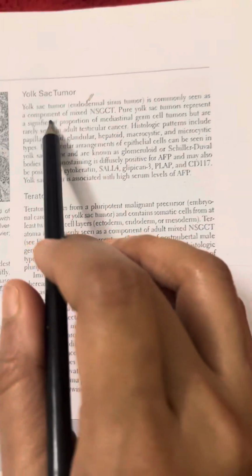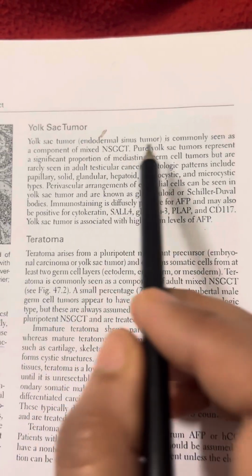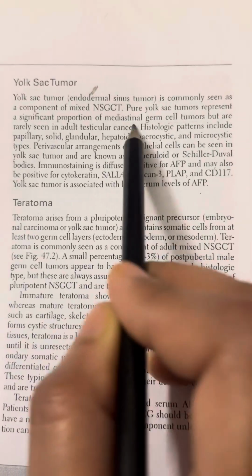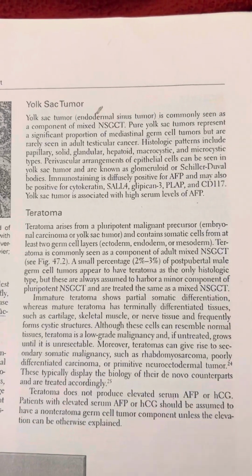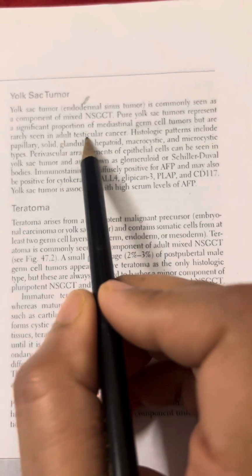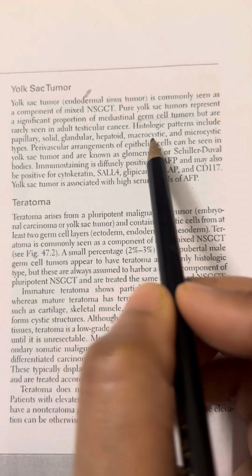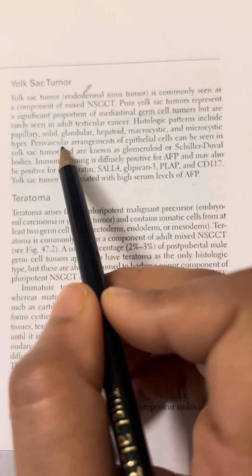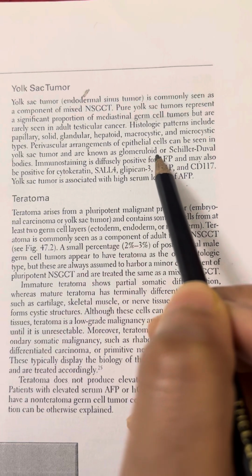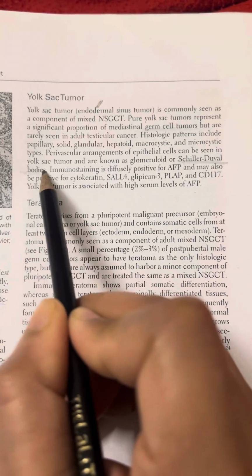So yolk-sac tumor. Yolk-sac tumor, or endodermal sinus tumor, is commonly seen as a component of a mixed NSGCT, and pure yolk-sac tumor represents a significant proportion of mediastinal GCT, but is rarely seen in adult testicular cancer. Histological patterns include papillary, solid, glandular, hepatoid, macrocystic and microcystic types. Perivascular arrangement of the epithelial cells can be seen in yolk-sac tumor and are known as glomeruloids or Schiller-Duval bodies. Yes, this is important: Schiller-Duval bodies.